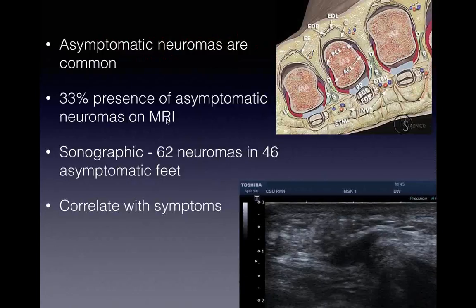An important thing to remember: asymptomatic neuromas are common. Once you get good at looking at these, you can see a lot and you need to correlate. A study showed 62 neuromas in 46 asymptomatic feet - that's a lot of neuromas. So correlate with the patient's symptoms: is that nerve angry? Is it getting inflamed when you push on it? Does it reproduce their symptoms? Do they describe the right symptoms?